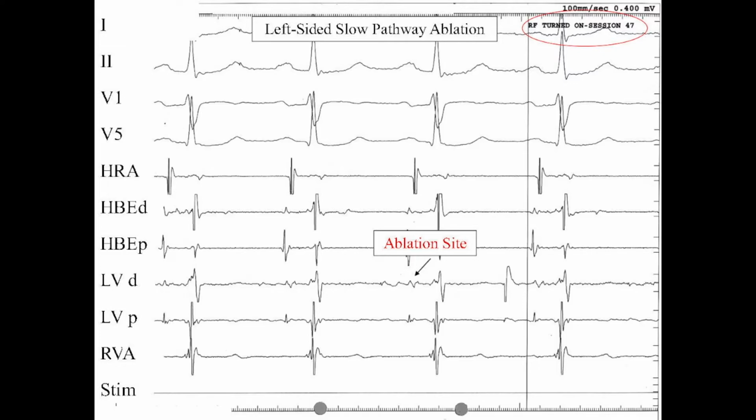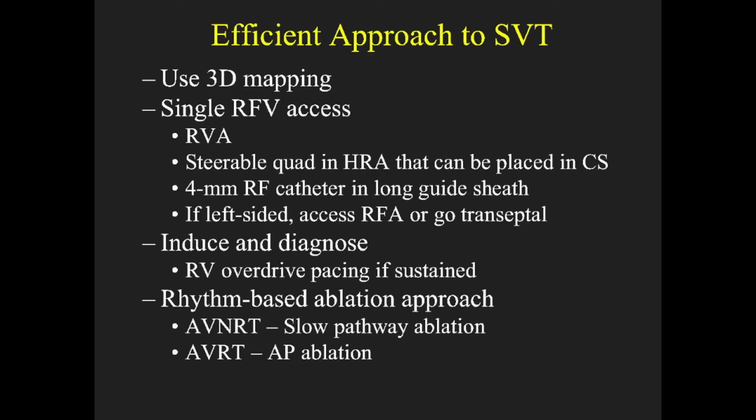Some highlights about accessory pathway ablation. I think this slide's a very good slide because it emphasizes the challenges that we face and some of the issues related to approaches to ablation of accessory pathways. So you can see here's atrial myocardium, ventricular myocardium. This is the mitral annulus, and this is the accessory pathway. So we talk a lot about whether they're epicardial or not. Most pathways are not truly endocardial. They are all on the other side of the annulus, but you can get them from the endocardium.